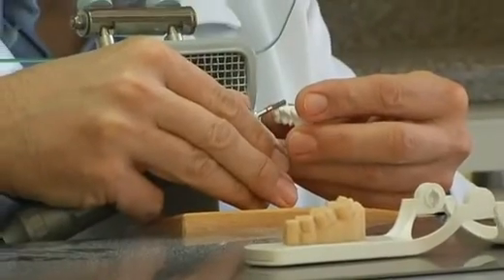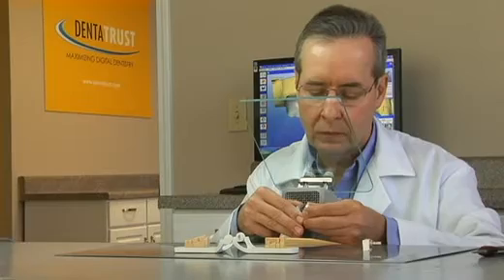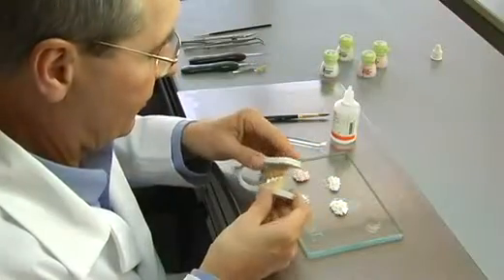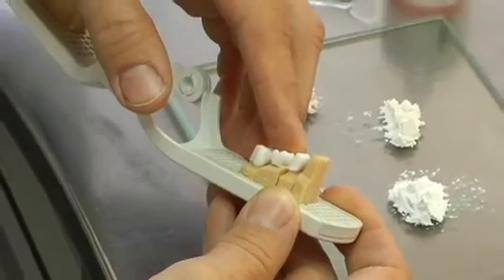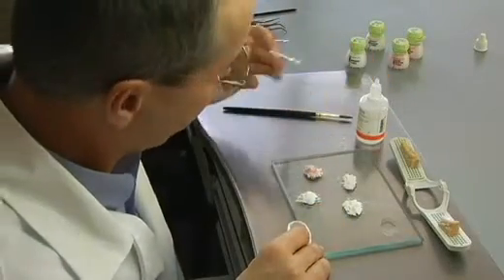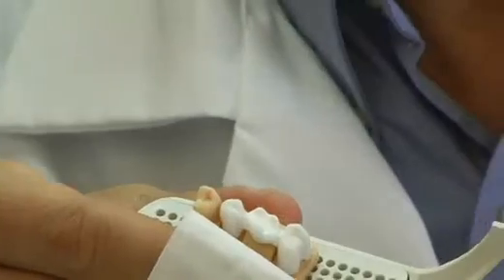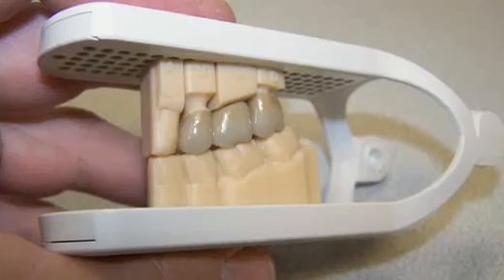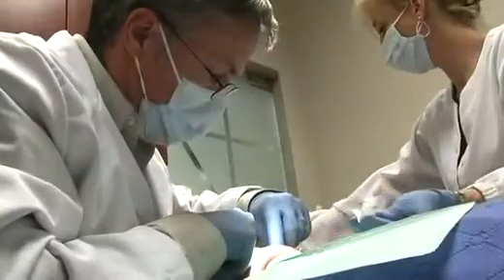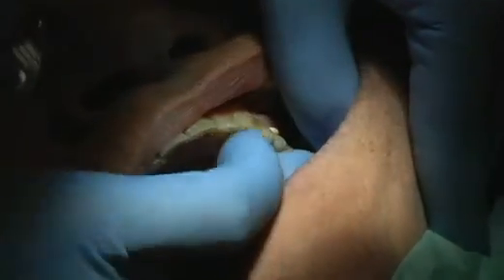The model is received back from Infinident, and the dental technician can start building porcelain and finish the case to the CEREC Connect model. Digitally fabricated CEREC Connect models enable the laboratory to fabricate any type of restoration that was previously only possible through conventional impressions and models, such as PFMs, zirconium oxide bridges, or gold crowns. Back in the office, the restoration arrives on the date you selected during the online transaction, and you are now able to seat the restoration.